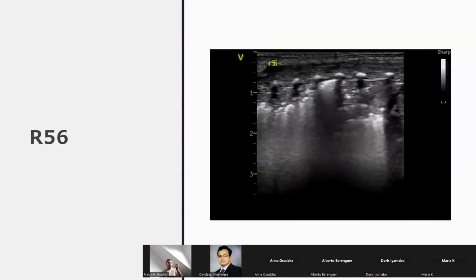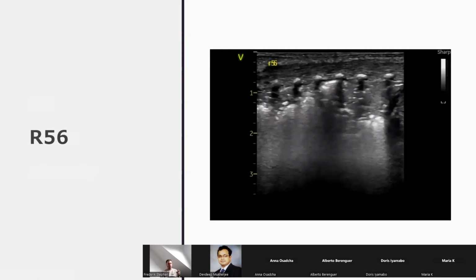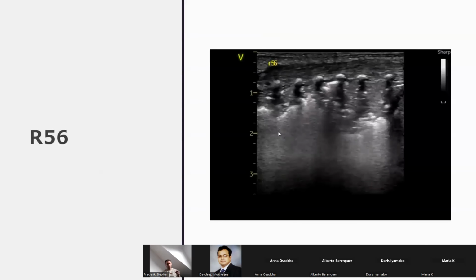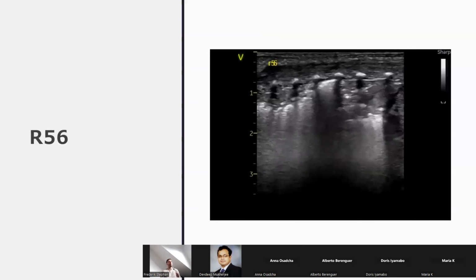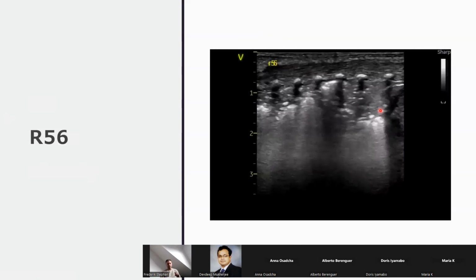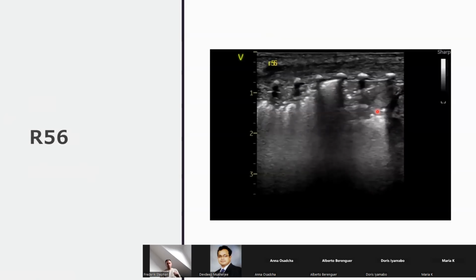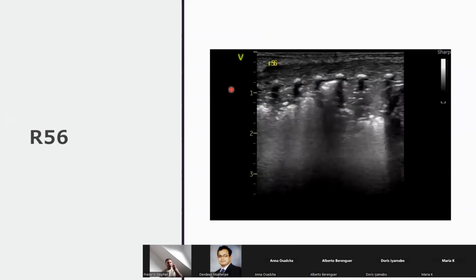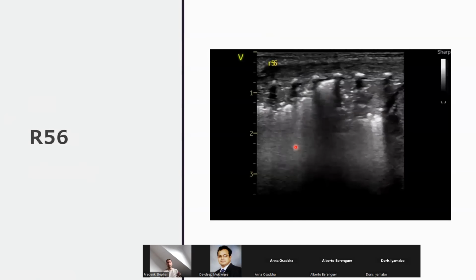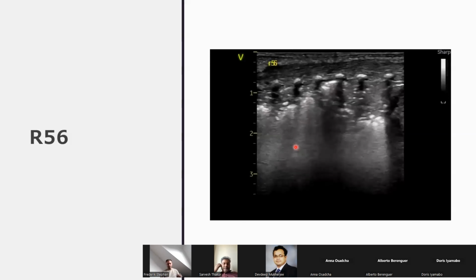I guess this is your baby, they're supine and they've got collapse and consolidation posteriorly in their lungs, particularly inferiorly. Anything else? Extensive atelectasis, maybe linear bronchograms. So there are linear shadows over here, static air bronchograms, and you can see quite extensive atelectasis on that right side. So the back of the lung is really, really worrying because it's not well recruited.